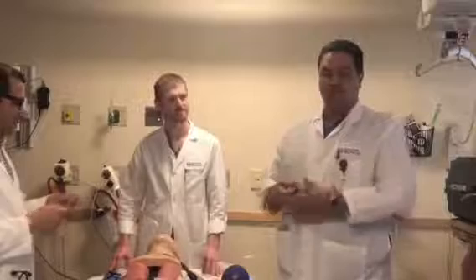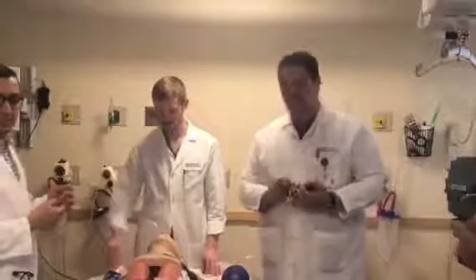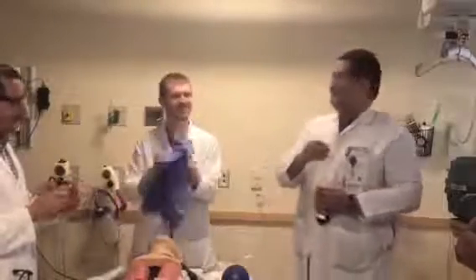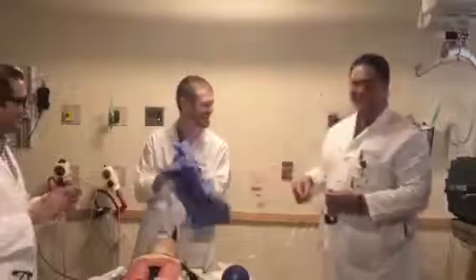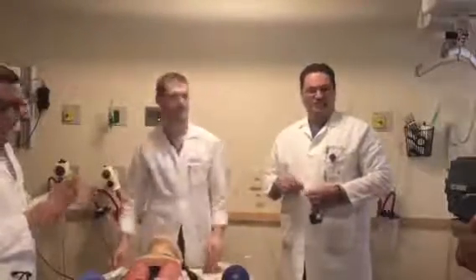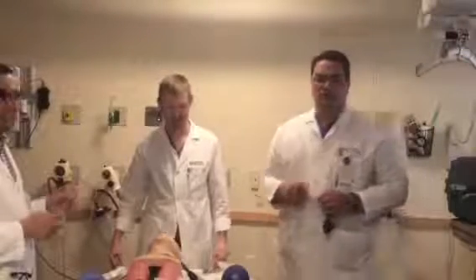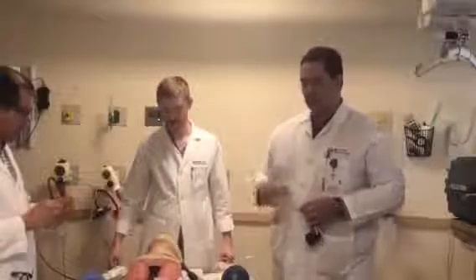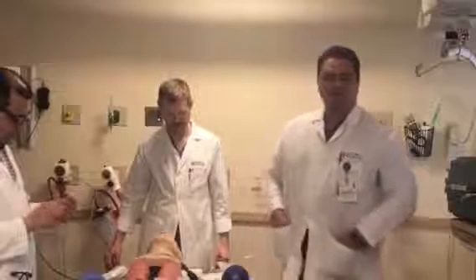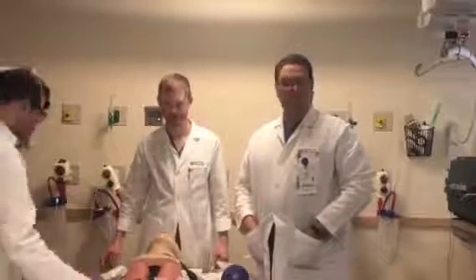Any questions? We have 10 minutes for questions. Is this done with gloves on? The infection control person caught us. Seriously, everything is done as sterile as you can? No, just regular gloves, none of that sterile. Not even for the cric. Just quickly, you know, everything is dirty here, and it's an emergency.